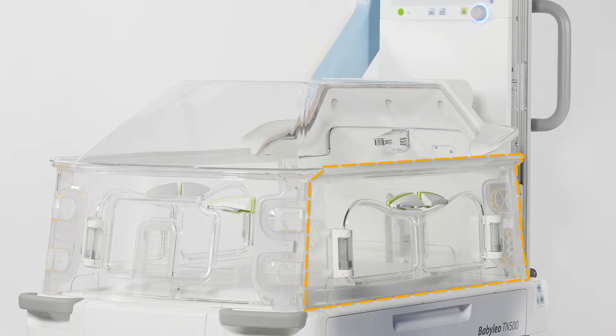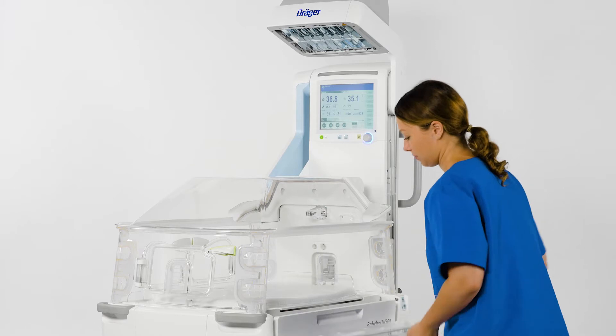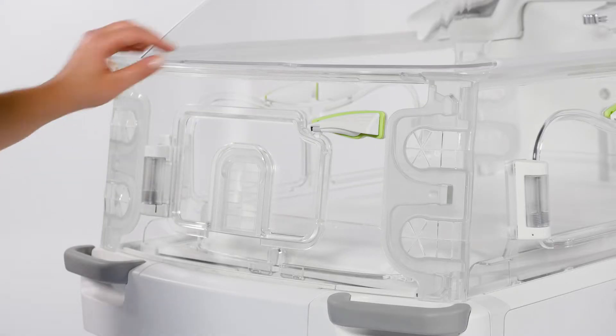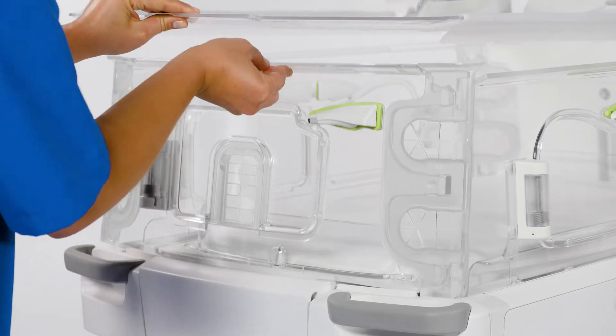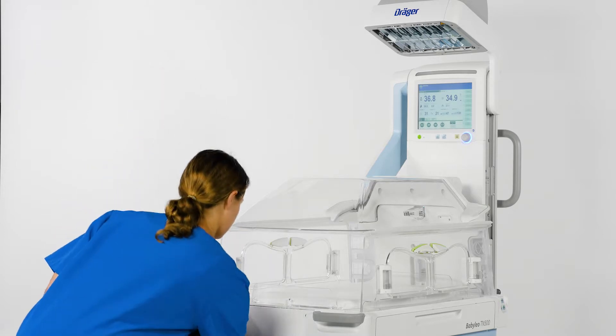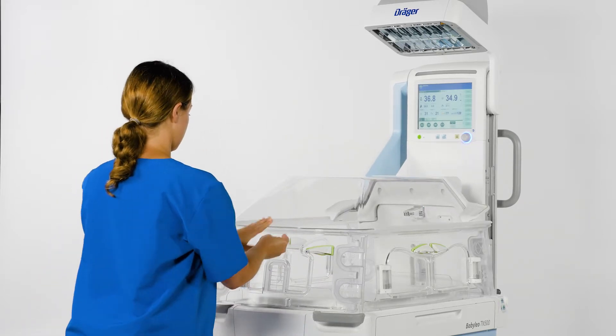To open the long side access panel, take hold of the recessed grip located in the middle underneath the top edge. Gently raise the access panel and fold it down. For the front side access panel, first gently raise the hood a little upwards. Then raise the panel and fold it down. To close an access panel, fold it up and lower it slightly.